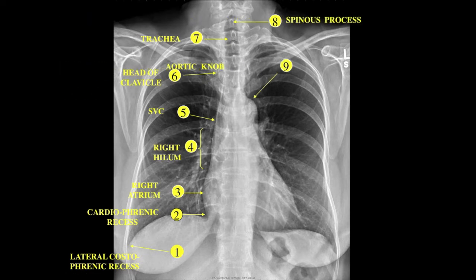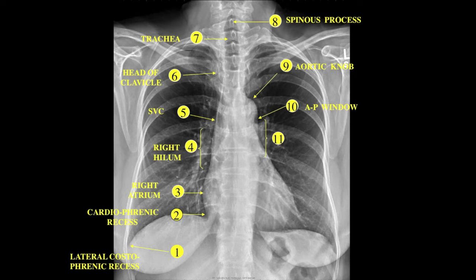The aortic arch manifests itself as an aortic knob-appearing structure. The space known as the aortic pulmonic window lies between the aortic arch and the top of the left pulmonary artery. Notice the left hilum is more superior in location than the right hilum because the left pulmonary artery rides over the left bronchus.